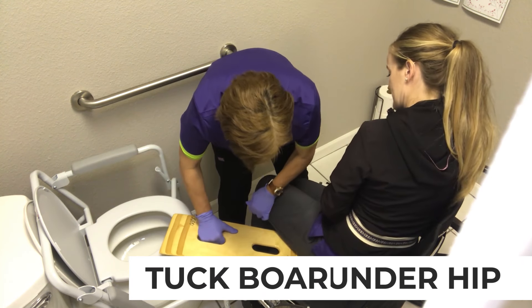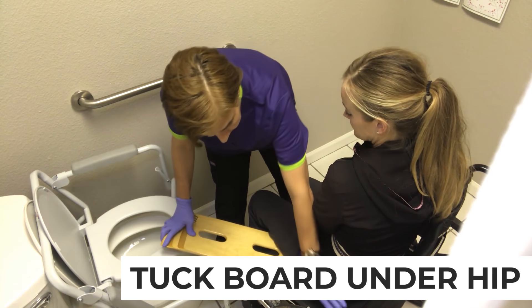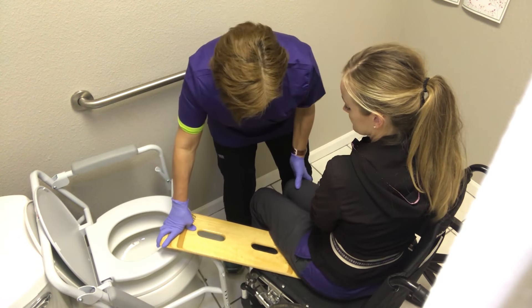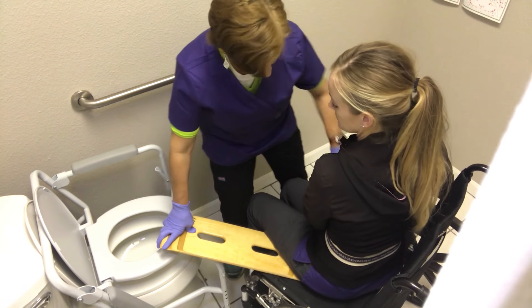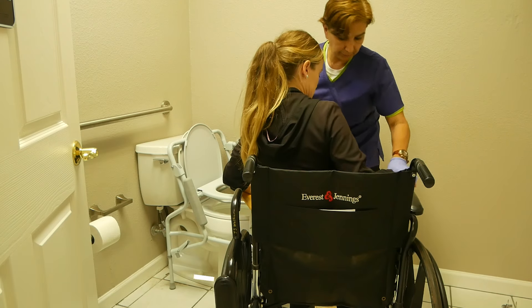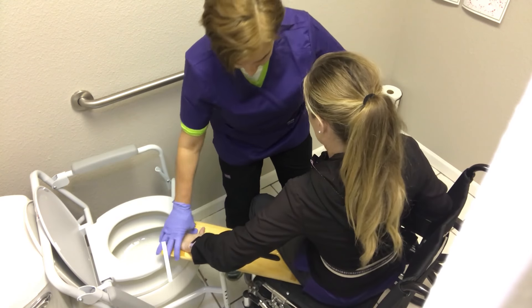You're going to tuck the sliding board under the hip. Make sure it's not too far back under the butt — you want it closer to the hip so they don't scoot off of it. You can have them put their hand there and push off here; I'm still controlling them with my knee.